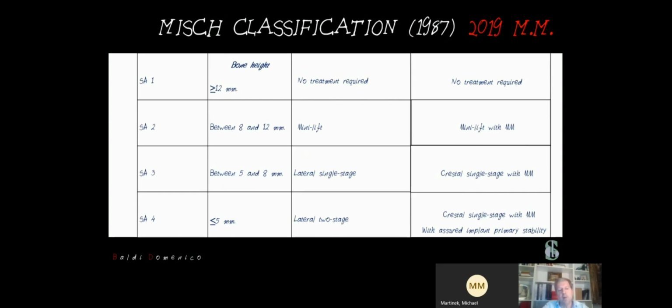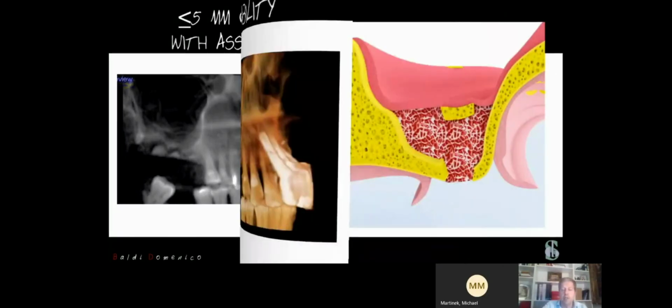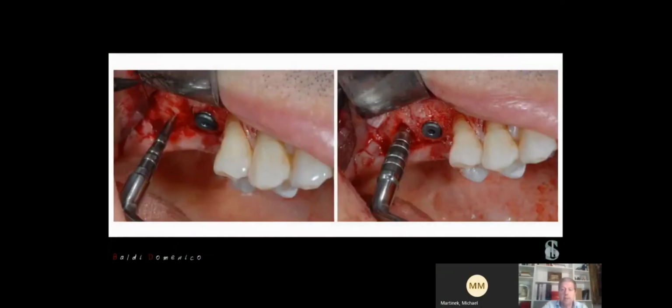And it's more important when we analyze cases like the clinical case that I showed you before, when we approach cases with a bone height less than or equal to 5 millimeters. So here now we can have the crestal single stage with the magnetic mallet. Of course, we must have implant primary stability. So if we finish the clinical case, you can see how we can approach the posterior zone, the second implant.